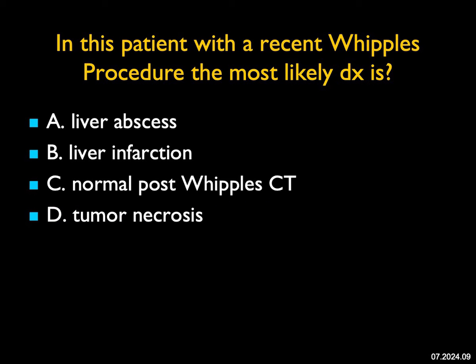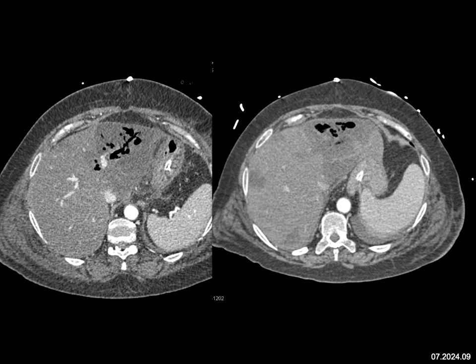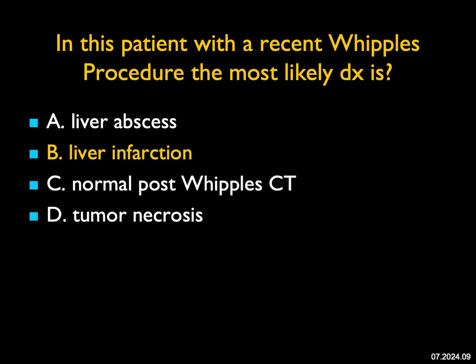In this patient with a recent Whipple's procedure, the most likely diagnosis: I see perfusion changes in the left lobe of the liver and also in portions of the right lobe. There are multiple air bubbles going along the biliary tree. This is not a normal post-Whipple CT, and this is not tumor necrosis — there was no tumor in the liver. This could be a liver abscess, but the sharp margins are really consistent with liver infarction. Liver infarcts can go on to become abscesses, so I'll give some credit for that, but the best answer — particularly with the other lesions in the right lobe — is an infarct of the liver.